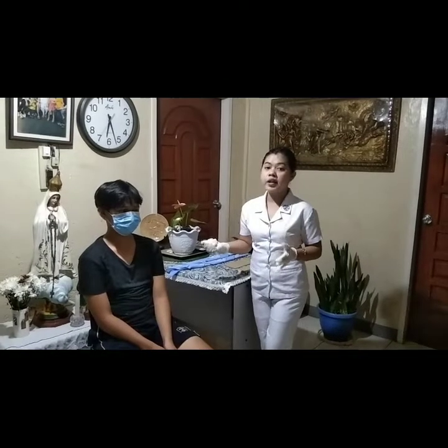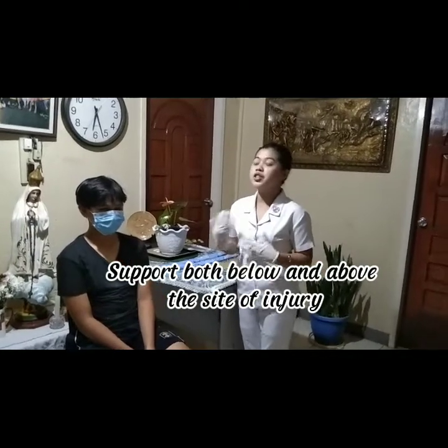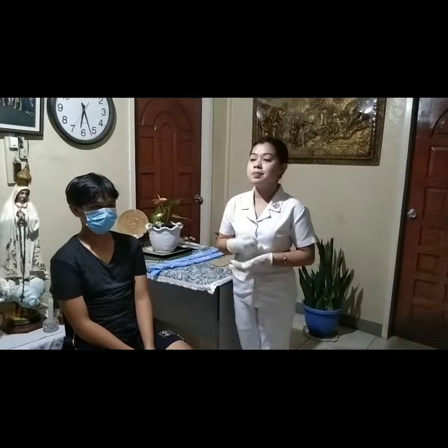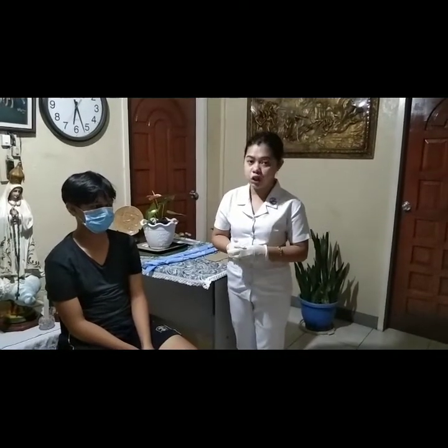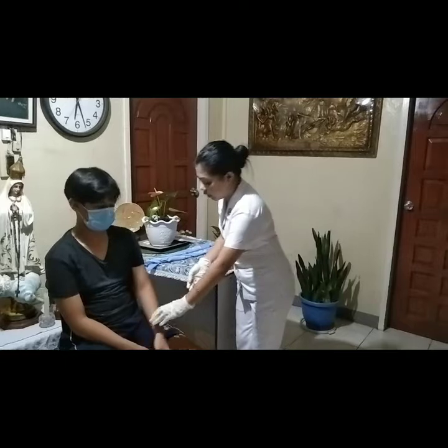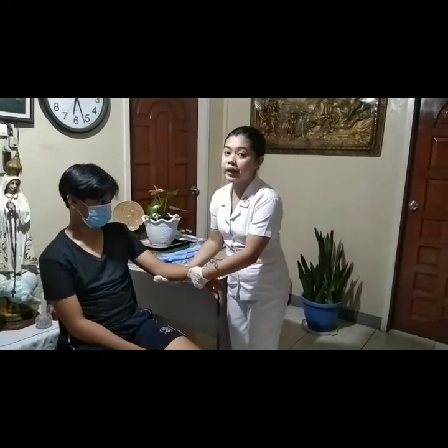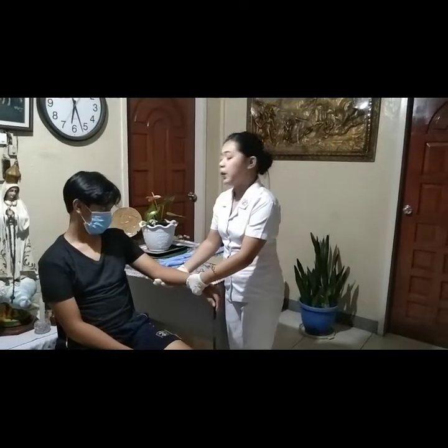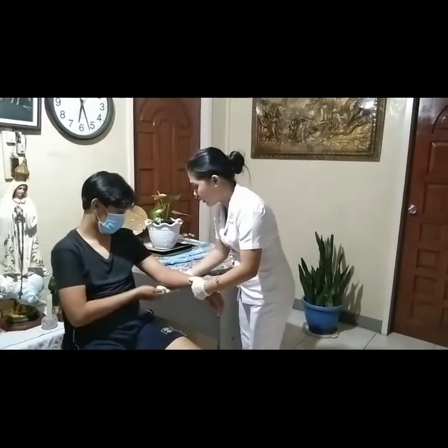Step 4, support both below and above the injury site. This will prevent further injury and minimize the pain during the splint application. So, sir, I will hold you, sir, okay? If you were alone, you can ask the patient to support his arm so that we can proceed to the next procedure. Sir, we'll just hold it, sir.